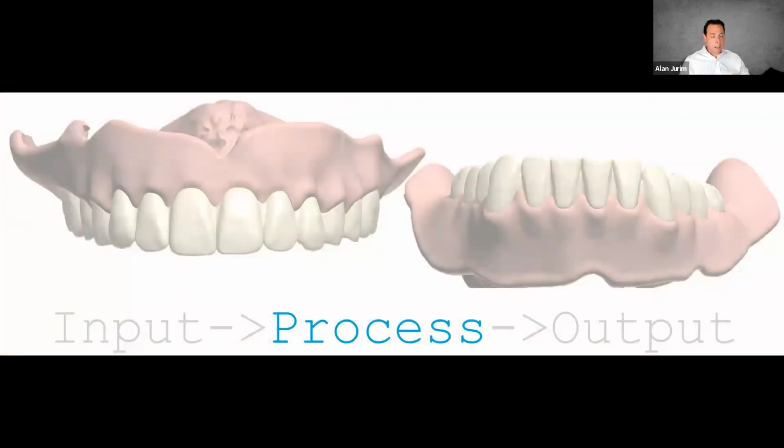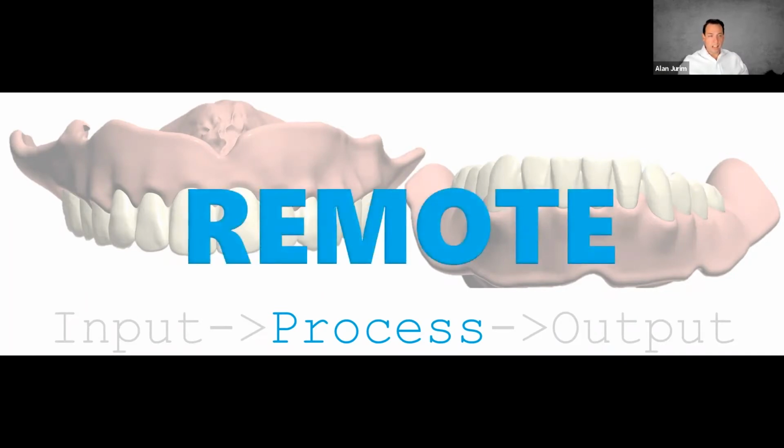Really fun, exciting stuff. Now, this is a key part. Whether you decide to do digital scanning, digital design, or digital manufacturing, right? Input, processor, output. This processing part, the part that involves design, does not mean that you need to become a designer. In fact, most of this can be done remotely. And this is what gets real exciting, because if you have the right team and you develop the right team, distance doesn't become a factor anymore. So you can collaborate like we never have been able to before, because of the benefits that remote processing and remote digital design afford to us.